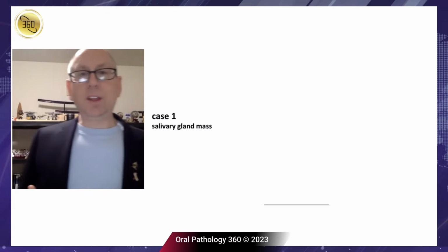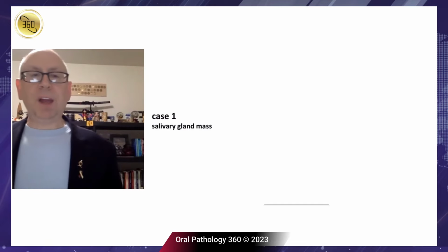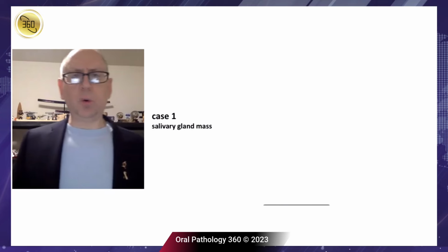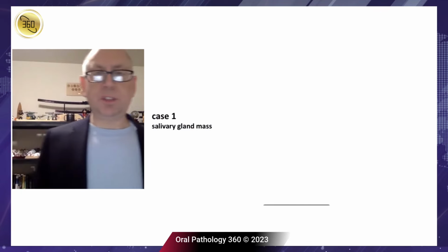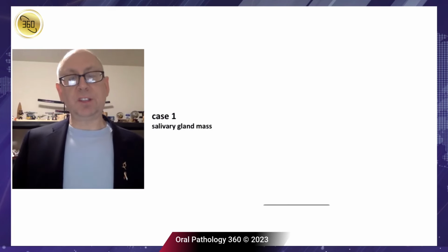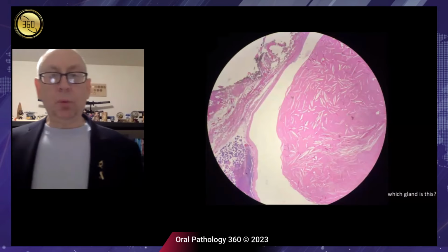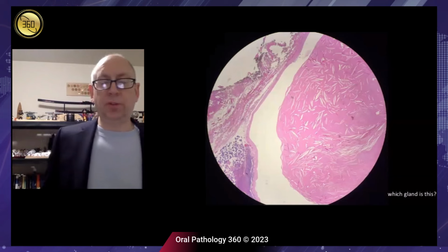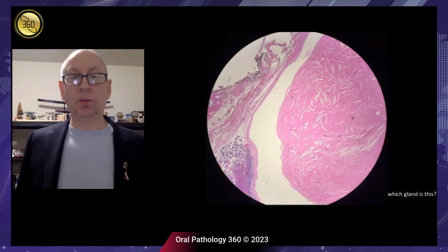So I'm going to start with an area that I think is fairly familiar to all of us. And we're going to start with salivary tumors. And my interest sort of has been in these low-grade salivary tumors that overlap with each other, right? The mucoepidermoid carcinomas, the acinic cell carcinomas, the secretory carcinomas, the cribriform adenocarcinomas. Sometimes they have overlapping histologic characteristics, and our job is to hopefully figure out which one we have. So I try to start all these with a 20x or a 100x view, and then we'll work our way up to about 200 or 400x.